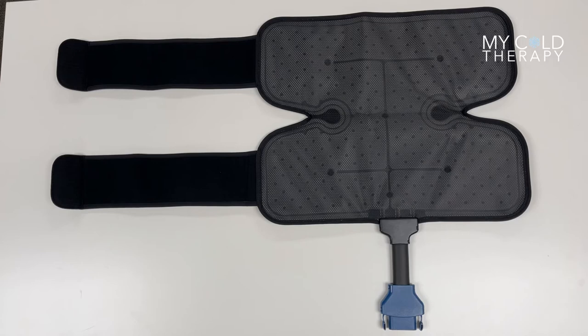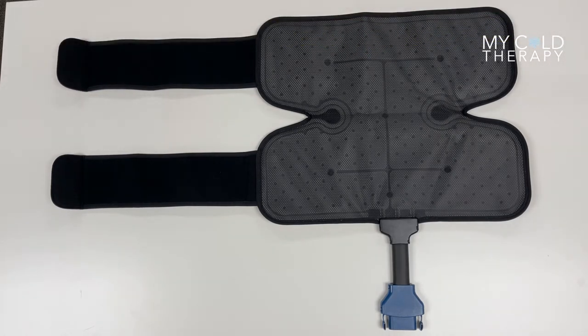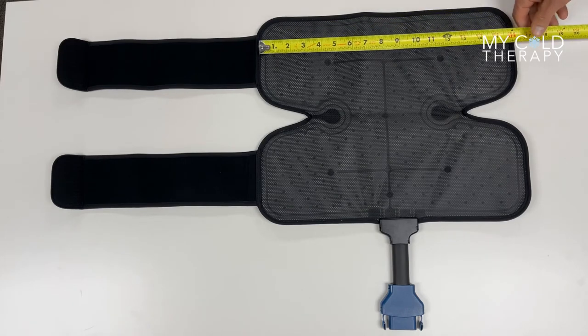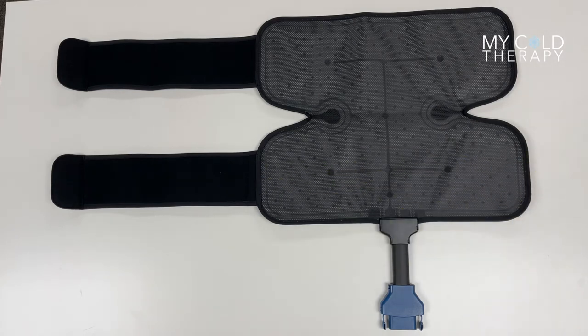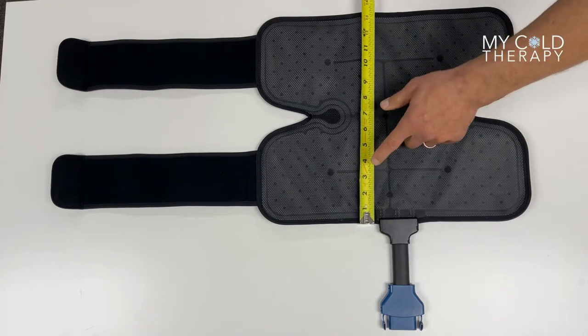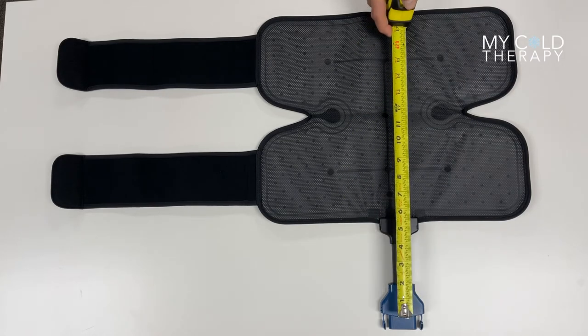It comes with two straps that are attached. Both of these straps are 13 inches long. The pad on the top is 16 and a half inches wide and 16 and a half inches on the bottom. The pad itself is 13 and a half inches and the hose is five and a half inches.